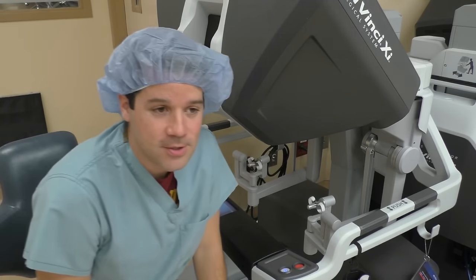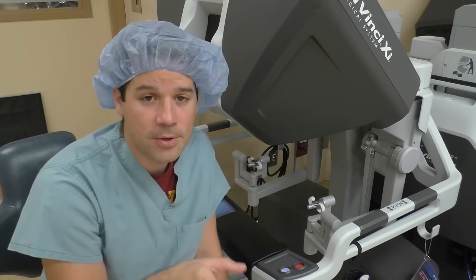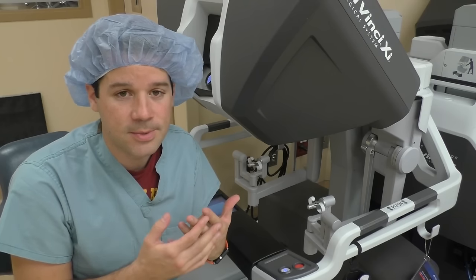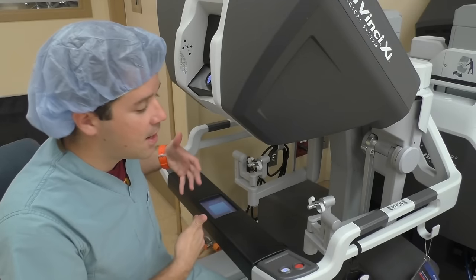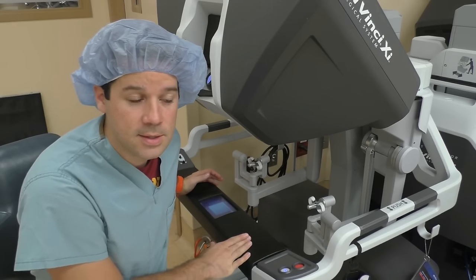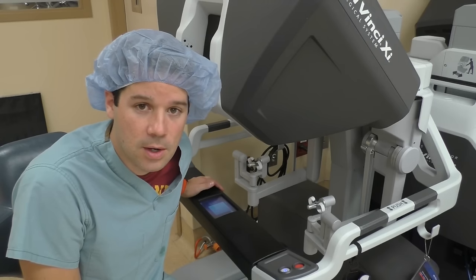The surgeon is only scrubbed in at the table while they put the trocars in and maybe help dock the robot, but once that robot is docked and the instruments are inserted in the patient and ready to go, that surgeon will scrub out, sit down at this console, and operate the entire procedure through this console until they're ready to close the wounds and the trocar incisions.